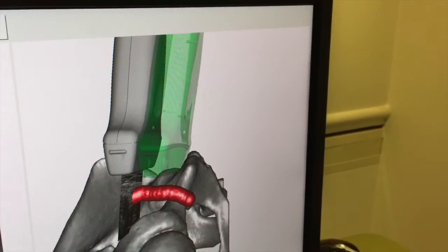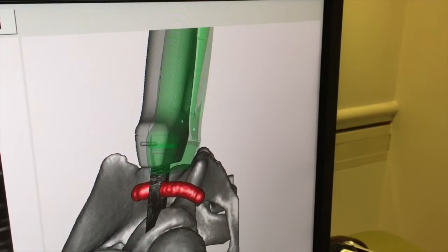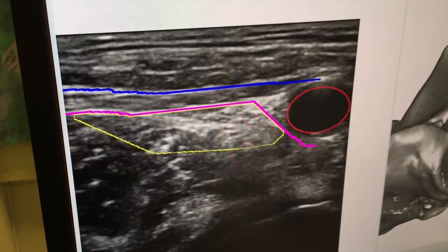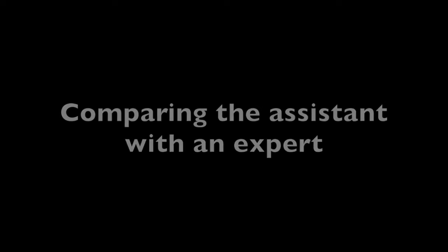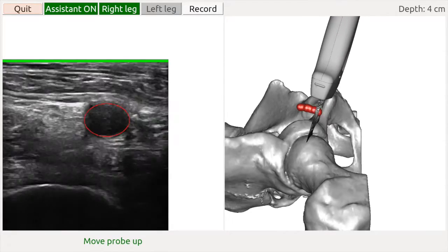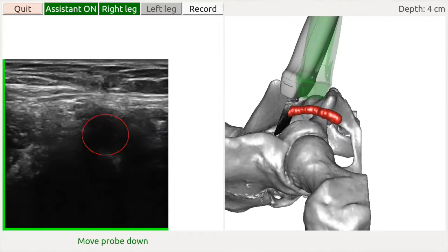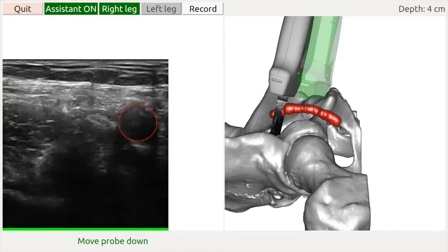When the green transparent probe appears in the 3D view, move the probe to align it with the green transparent probe. After the target area has been reached, the nerve and fascias will appear in the ultrasound image. We will now compare the assistant to an expert. The experienced anesthesiologist was asked to put the probe where he normally would, scan down to the bifurcation and up to the inguinal ligament, and end up in a probe position where he would insert the needle. The data was recorded without any assistance.